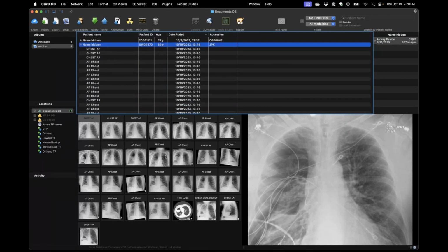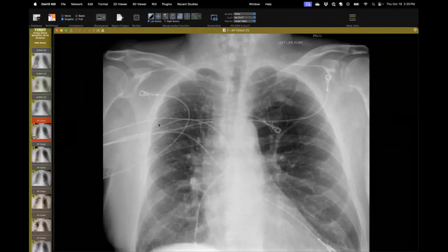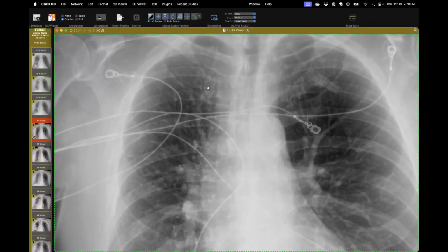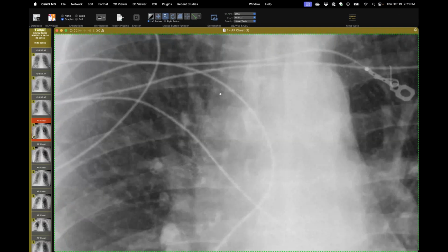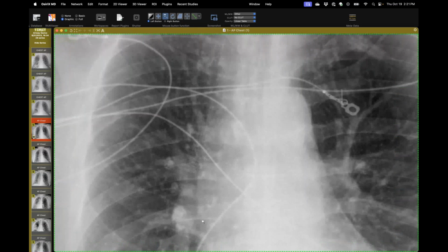But this patient has COPD and underwent endobronchial valve placement. We're doing a lot of these here, and you can see these are the Zephyr valves right here. That's our preferred valve, and they pick the lobe with usually the most emphysema and also the best fissures.